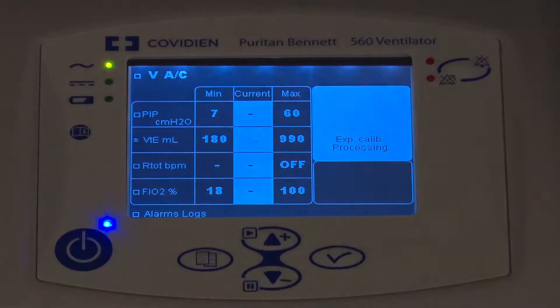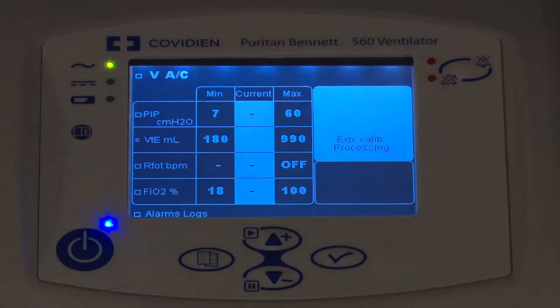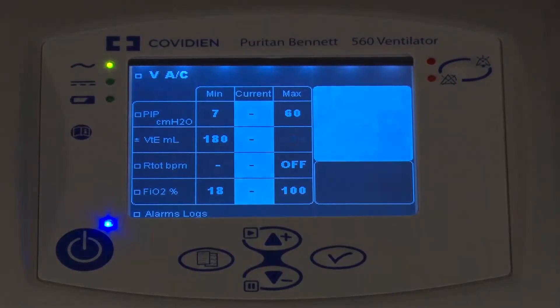I want to make sure that the end of the circuit is occluded, either with your hand or a gloved hand or the cap here. Right now it's in the process of doing the exhalation calibration. This takes probably about a minute. Initially you don't hear much flow, but eventually you'll hear the flow ramp up. It has just passed the flow sensor calibration.